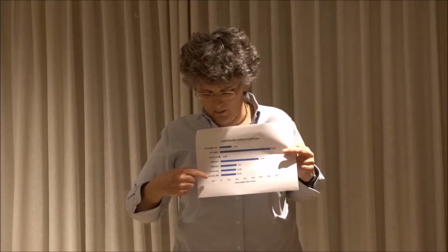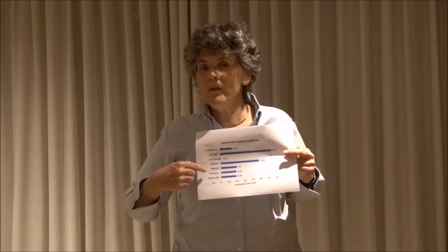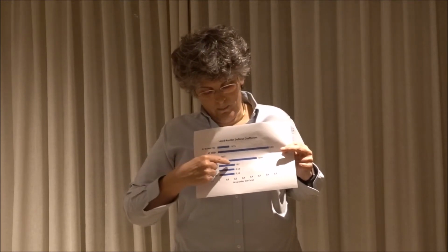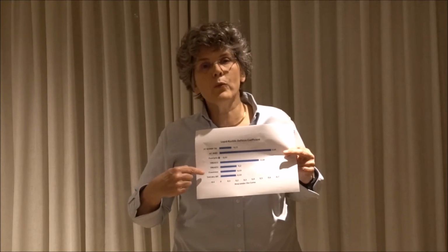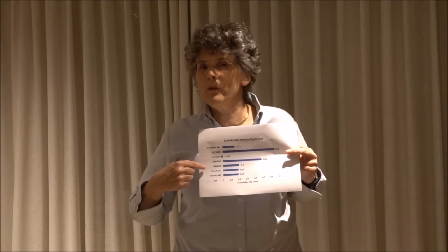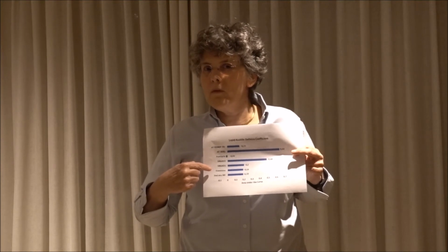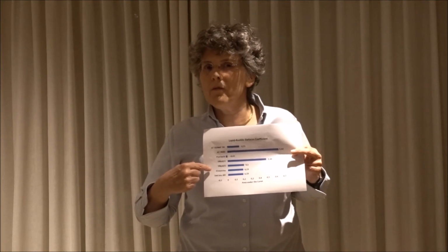Now we can see under here that bifocal IOLs of newer generations and trifocal IOLs more or less function the same. All their Lapid-Kushlin defocus coefficients are 0.2, 0.19, 0.19, which means it's quite good. And also that there isn't a lot of difference between the older trifocal IOLs and the bifocal IOLs. So this may lead us to think differently about multifocality and trifocality or bifocality in multifocal IOLs.